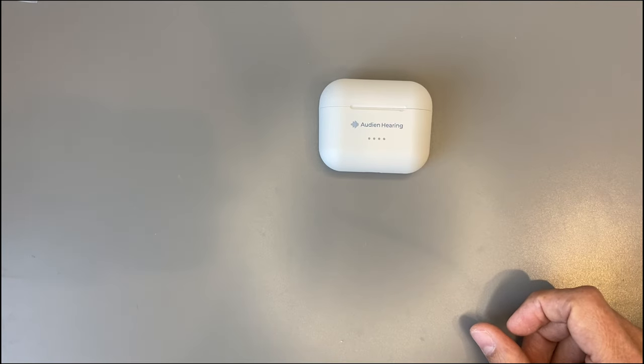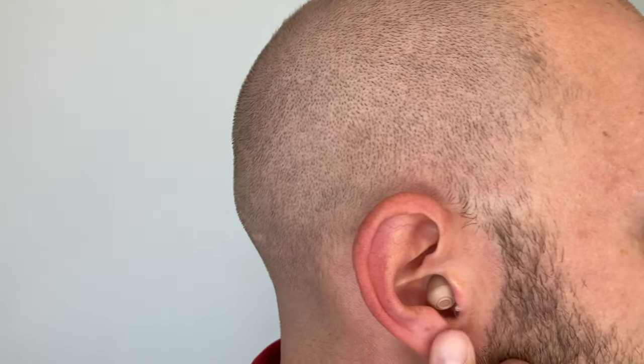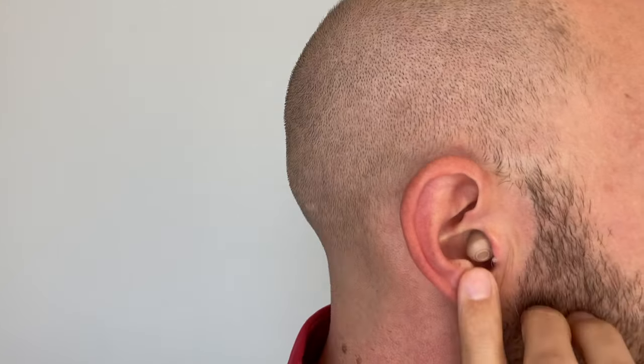We'll charge the devices and then see how those hearing aids sound. Now, how do these hearing aids look while wearing? These are very small in-the-ear hearing aids — you can see they sit pretty deep in the ear and from the front they're nearly invisible.